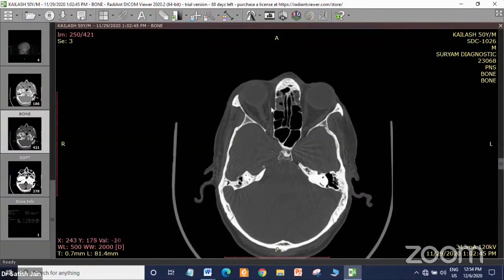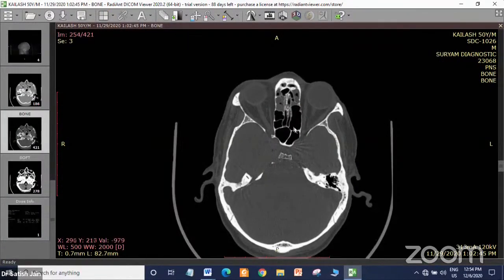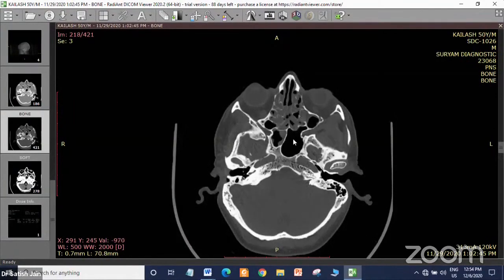This is your medial rectus muscle, and this is your lamina papyracea anteriorly. There is 4.5 or so, 4.8 millimeter of fat between the lamina and the muscle anteriorly, in the anterior ethmoid majorly. In the posterior ethmoid, there is no fat in between. If you injure the lamina, your muscle is right there. Any distance you can measure in any plane, any angle.